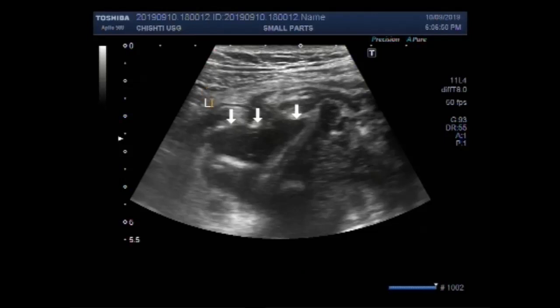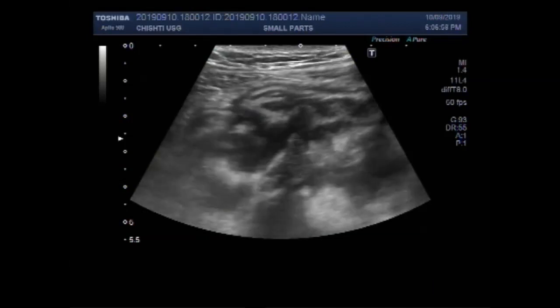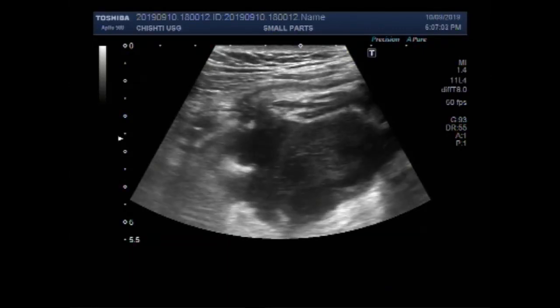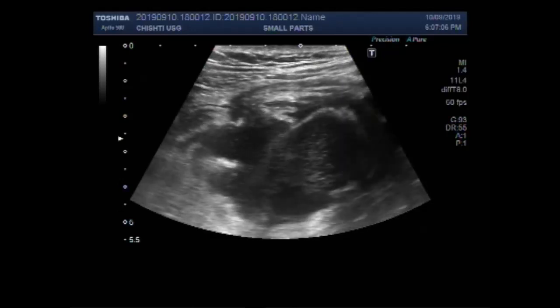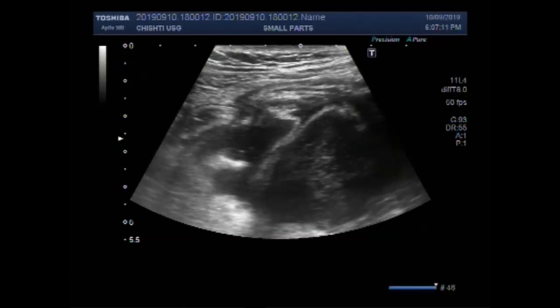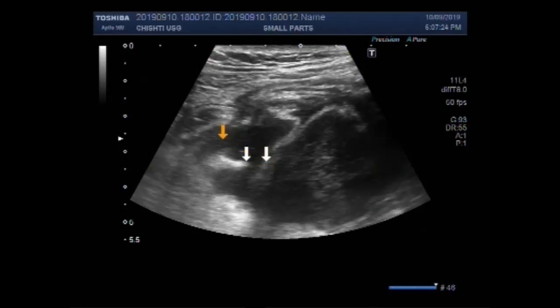Now, this is the leaked appendix. And you can see the fluid collection having a communication with the appendix — this is the communication with the appendix from where the fluid is coming out.